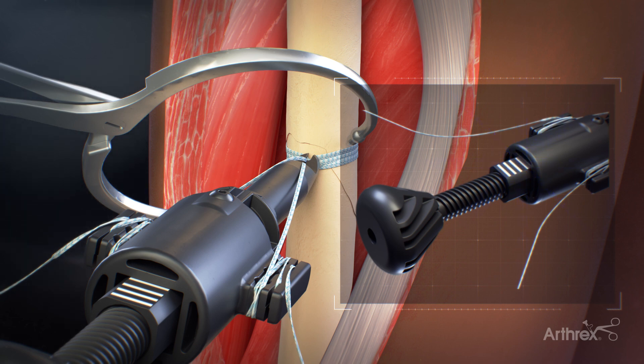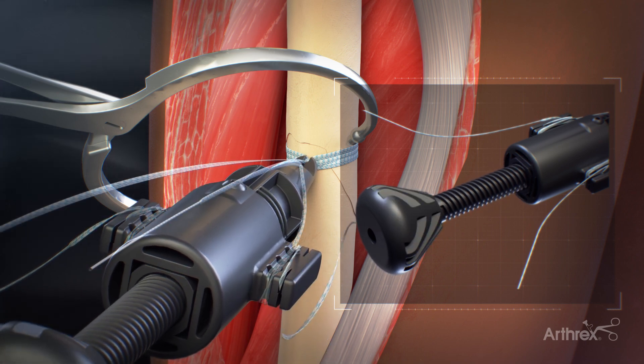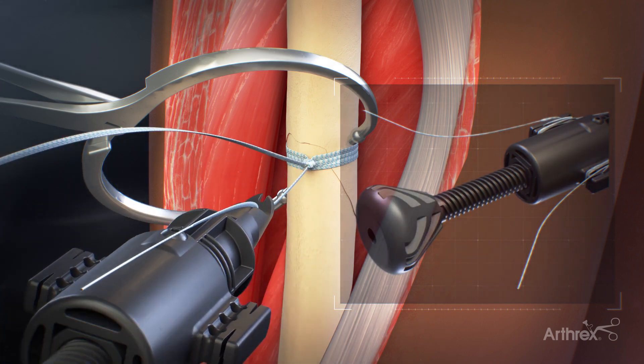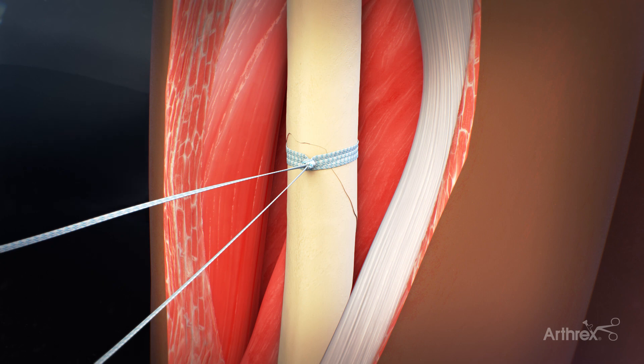Once tension is achieved, remove the tensioner by turning the handle counterclockwise until the suture limbs around the suture wings loosen. Unwrap the suture tails from the suture wings. A half hitch is tied to secure the knot and aid in retaining the cerclage's tension. Additional cerclage may be added if necessary, following the same steps as previously shown.